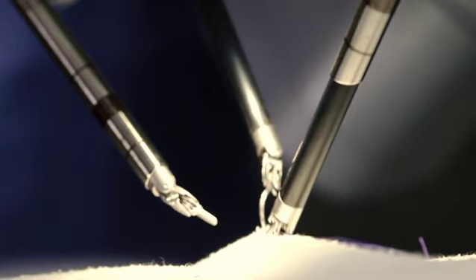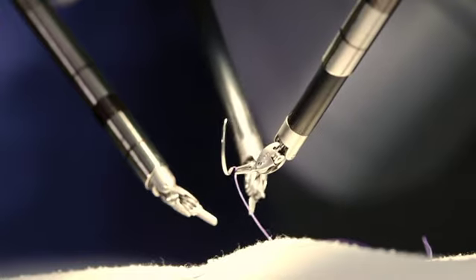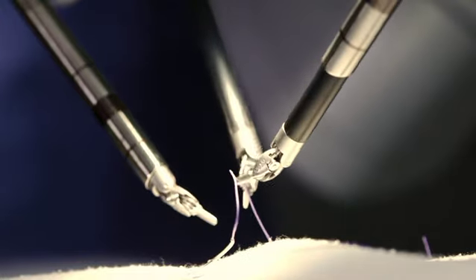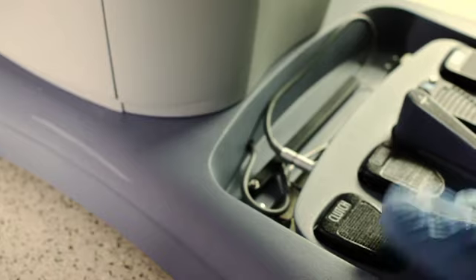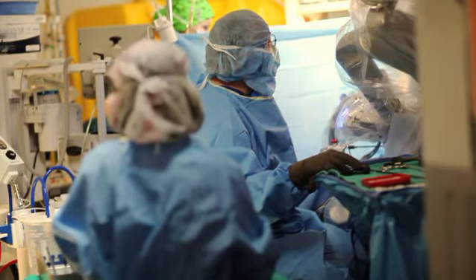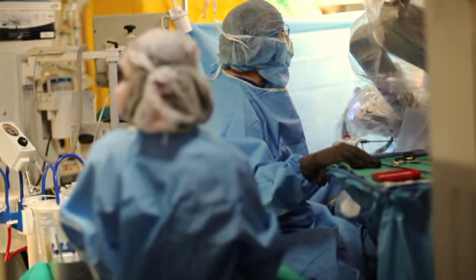The robot sits above the patient. It has several mechanical arms that hold a camera as well as surgical instruments. The surgeon uses hand controls and foot pedals to manipulate the robotic arms.